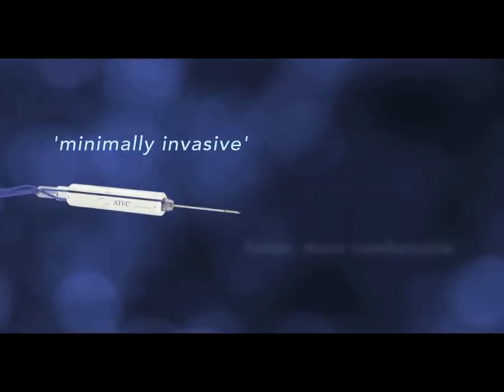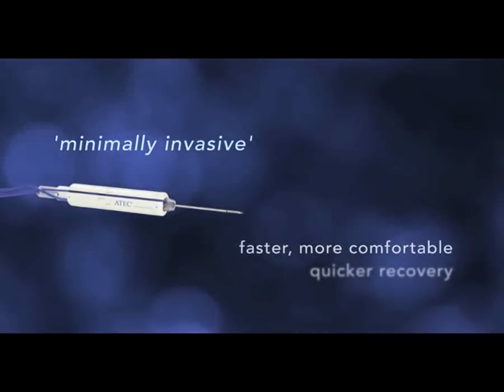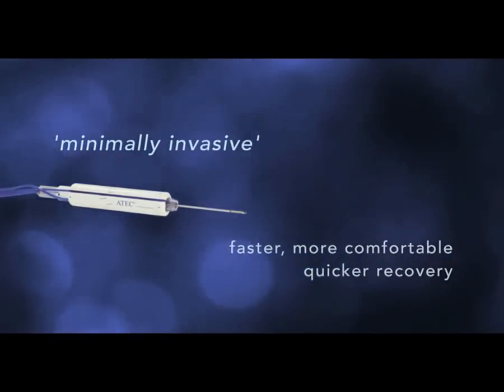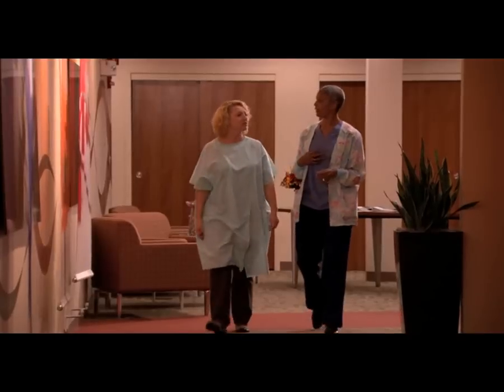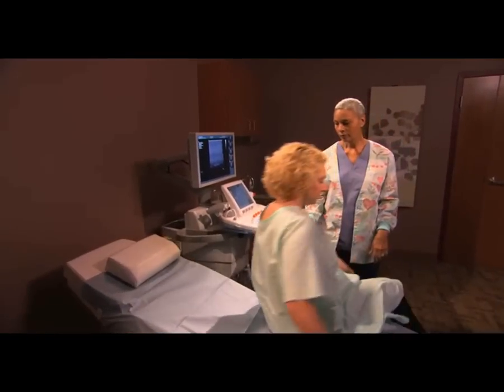Today, we have minimally invasive methods for sampling the tissue. That means we use a needle to take the sample with an imaging system for guidance. It's faster and more comfortable than open surgery, and your recovery time is much quicker. Of course, it's okay to be nervous about any medical procedure, but it's really not quite as scary as it sounds. And it helps to know ahead of time what's going to happen.